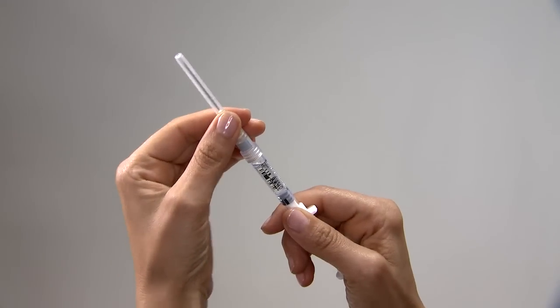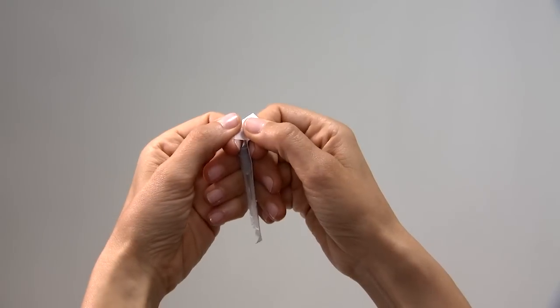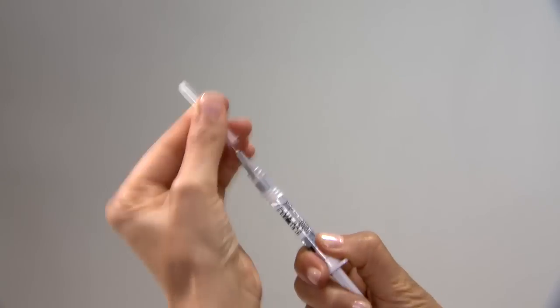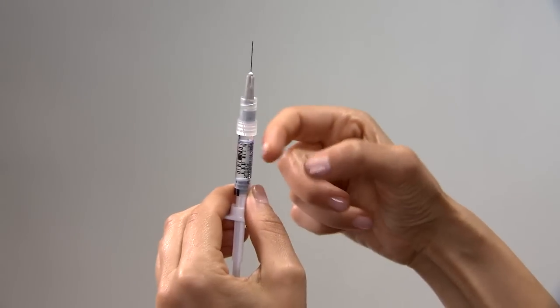Detach the mixing needle from the syringe and lay down the syringe. Remove the wrapping from the gray injection needle. Twist the injection needle onto the syringe and remove the cover of the needle. Remove any bubbles by pointing the needle up and tapping on the syringe. Push the plunger carefully until a small drop of liquid begins to appear from the tip of the needle.